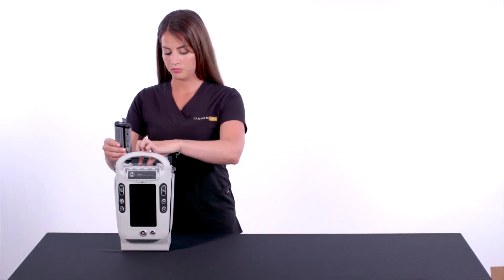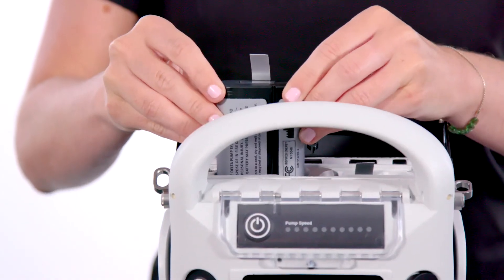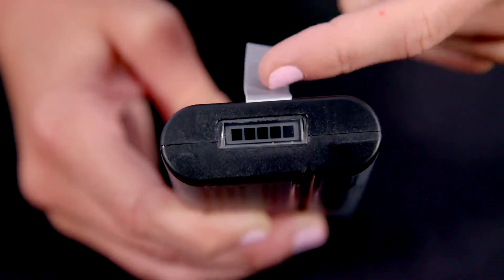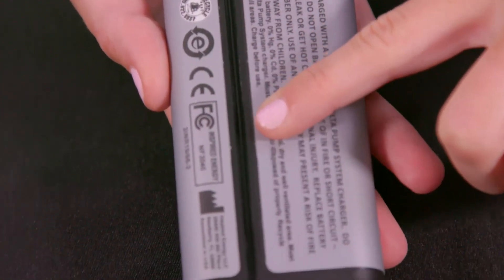Prior to powering on the system, ensure that the batteries are properly installed in the LifeSpark controller and dock. The system includes four batteries complete with a charge status indicator, a removable tab, and a specialty keyed battery housing.